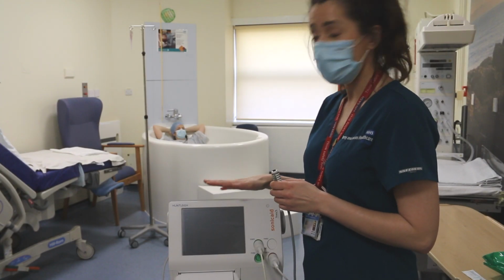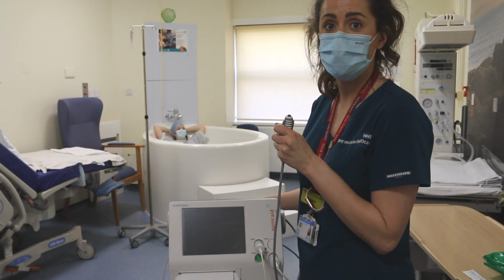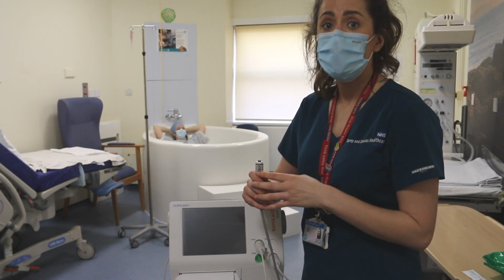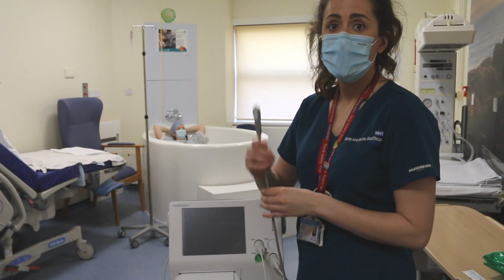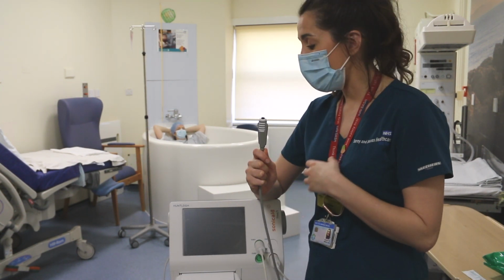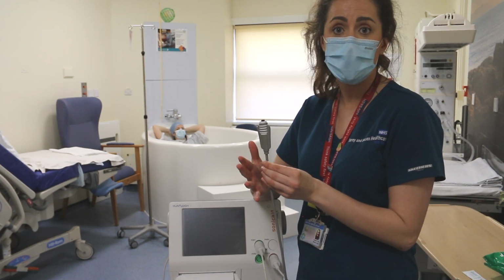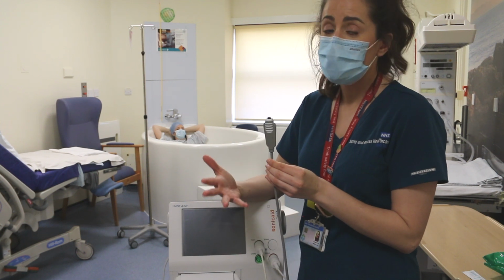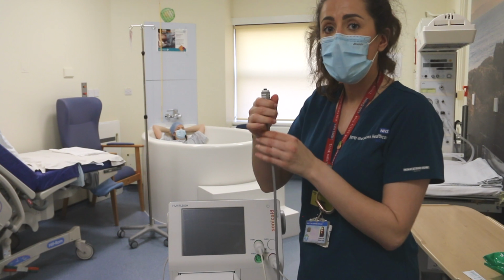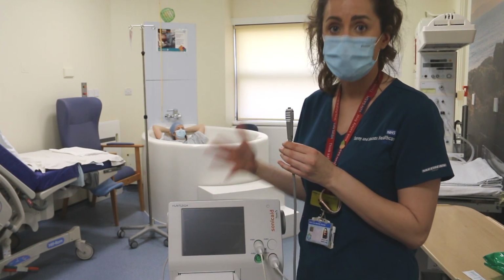So all CTG machines have the ability to have a fetal movement button included. So this isn't really necessary for labour, but all antenatal CTGs must have the fetal movement button attached and in use. So when you're starting an antenatal CTG, it's of vital importance that you instruct the woman that whenever she feels a fetal movement, she gives the button a press.